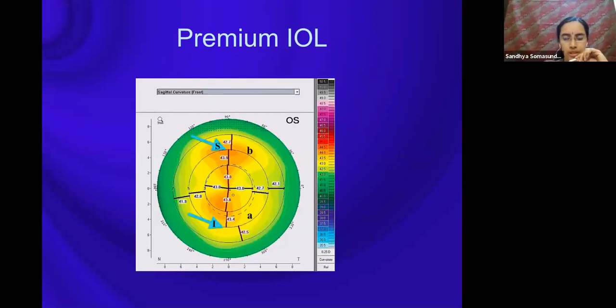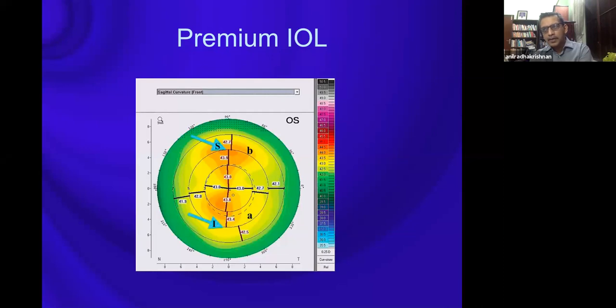So it would be better for us as a screening tool, right, sir? Definitely, it is a screening tool. But the only thing is, in the Placido-based, you're looking only at the anterior curvature of the cornea. And the disadvantage is that beyond the central, say 6.5 millimeter, it may not give you good values. So you cannot get limbus to limbus imaging, unlike Pentacam.